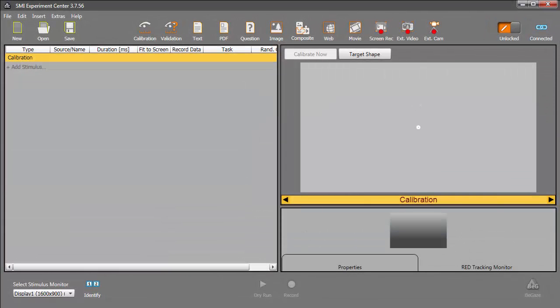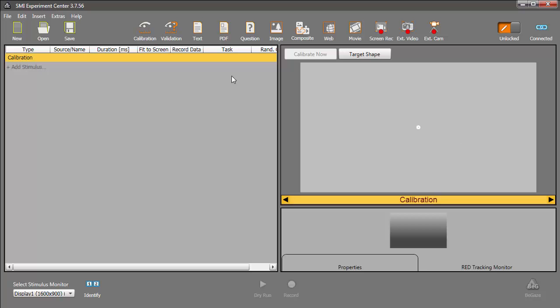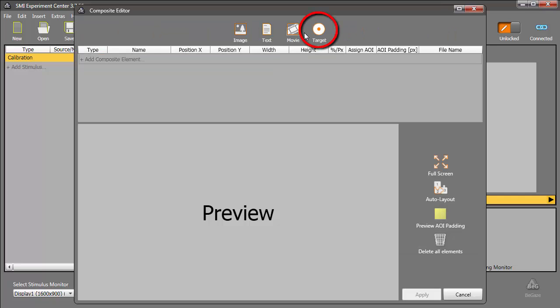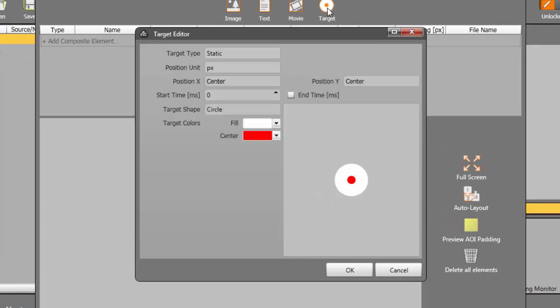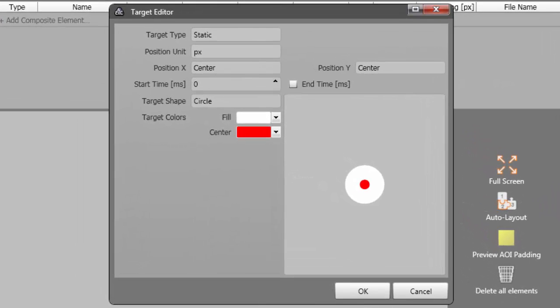Let's start by creating a very simple reflexive saccade task in Experiment Center. This will consist of a fixation cross followed by a circular target on the right side. This is easily created as a composite stimulus. I'll open the composite editor to begin. Once the editor opens, I'll select the target stimulus. The target editor appears, so we can define our options.